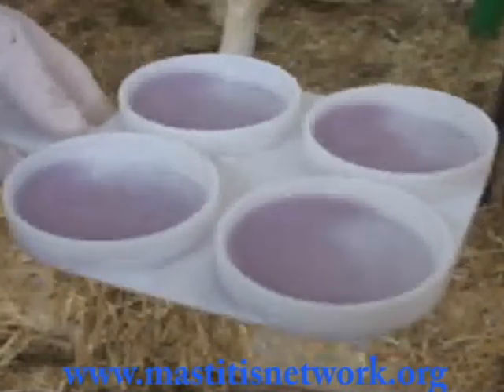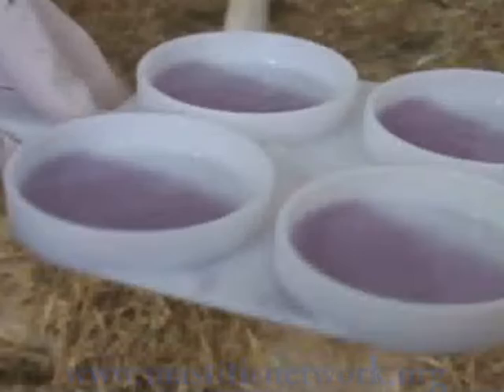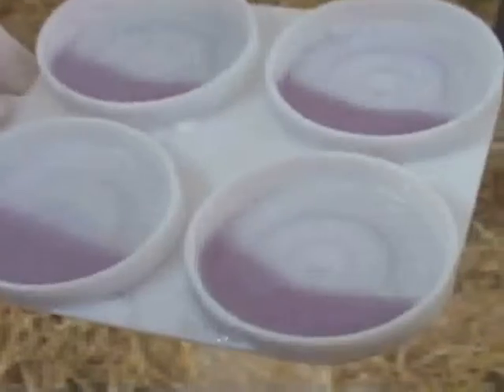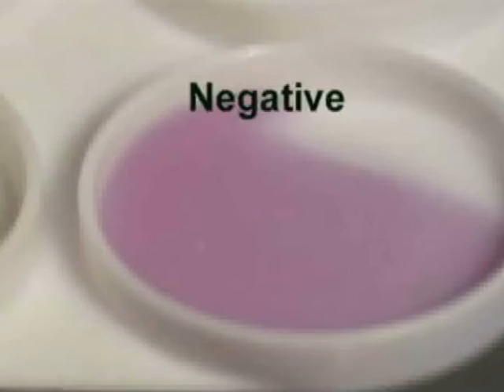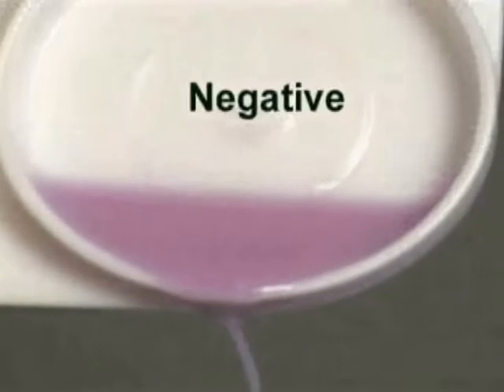You must interpret the results for all four quarters immediately. Maintain the swirling action and tilt the paddle from side to side and watch for any gelling of the mixture. Then, pour out the content of the paddle and watch closely to see how the mixture pours out. Let's start the interpretation with the negative reaction. Here, the cup contains healthy milk. The mixture remains liquid and homogenous. When pouring out the paddle, the mixture drips out normally.